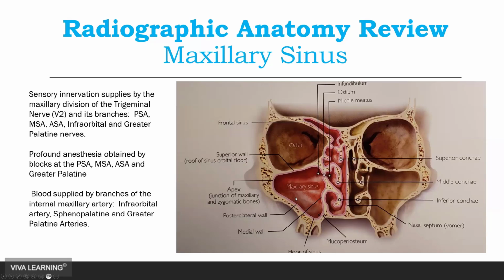Unless you really just want to touch the surface of doing simple, straightforward lower molars or something like that, because you'll realize that more than half of the teeth that patients lose are in the posterior maxilla for a number of reasons. And a lot of times, if they've lost a tooth for any amount of time, or even if they haven't, they're going to need some sort of sinus augmentation.